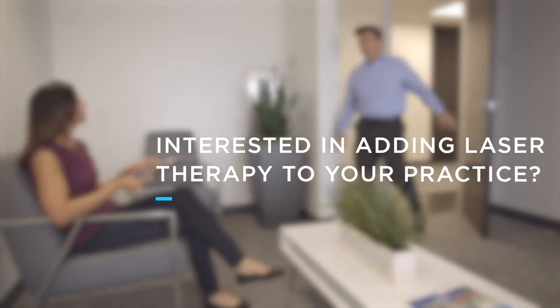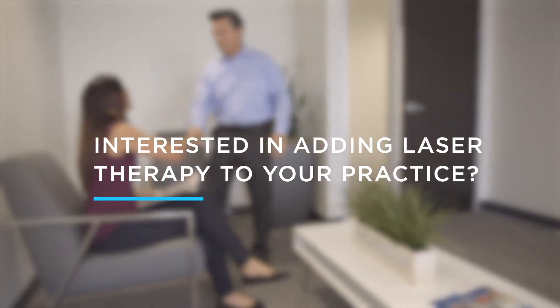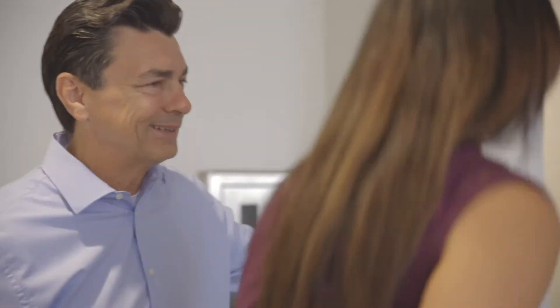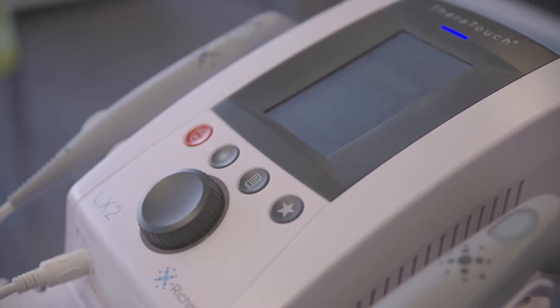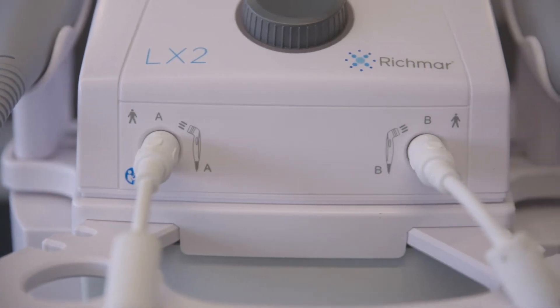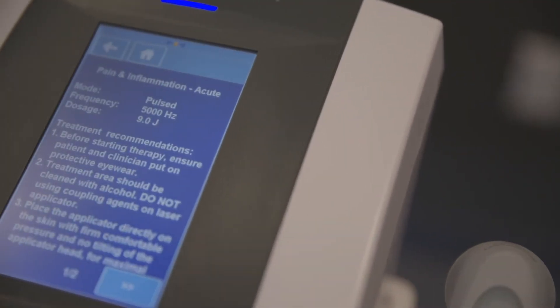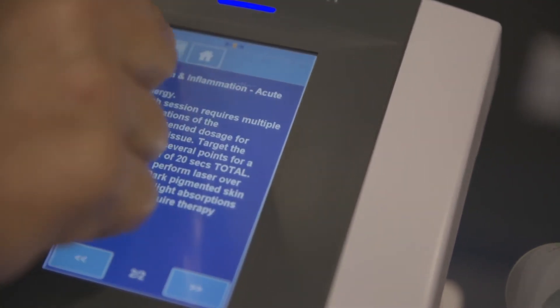Are you interested in adding laser therapy to your practice in order to better relieve pain and inflammation as well as assist in tissue healing? Consider Richmar's Theratouch LX2 with included laser applicator, real-time dosage calculator, and selectable clinical protocols.